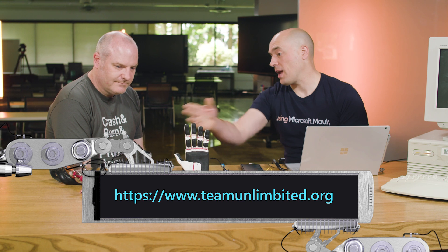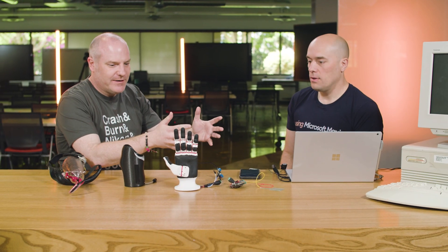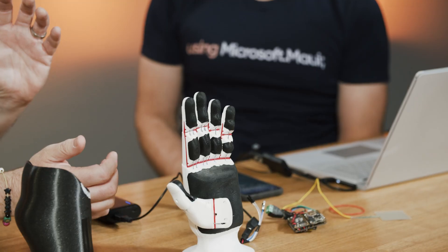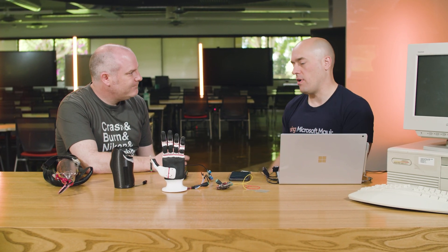What that does is effectively replace the hook at the end — so instead of a metal hook, it's a hand that closes. And this is literally printed with a home 3D printer — you don't even need a big commercial setup. A cheap home 3D printer, just download the files. You can use basic printers like an Ender 3, which cost around $200, or a Prusa printer at around $800, which is what this is done with. Either way, we're still less than $1,000 — and the material for the hand and the rest of the arm costs less than $10 to print all the parts.